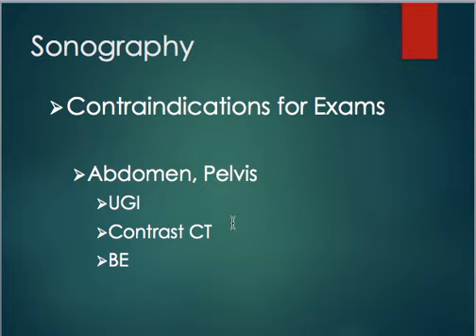So the patient can have these exams on the same day. The ultrasound just has to be scheduled first before the contrast is put in. That way they can scan them free and clear of any contrast. Then the patient can go on to have their contrast studies and everything will be fine.